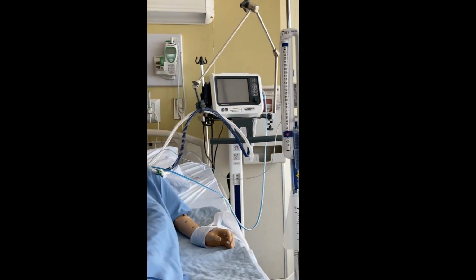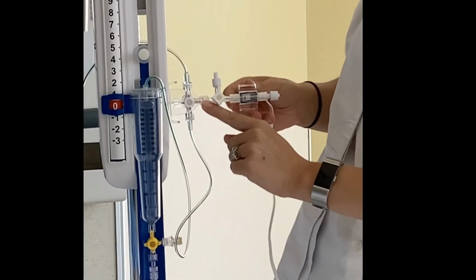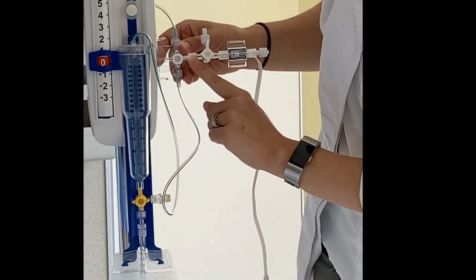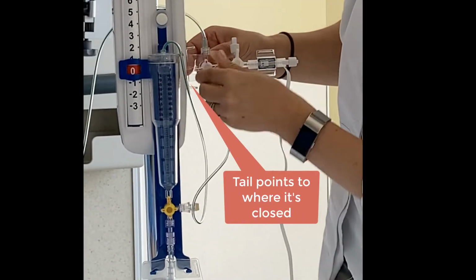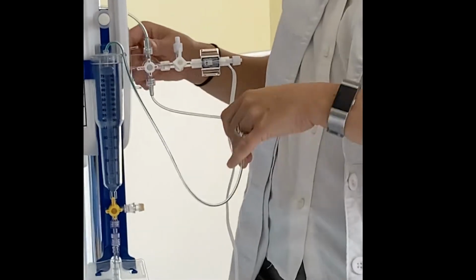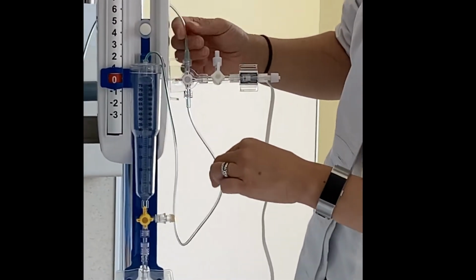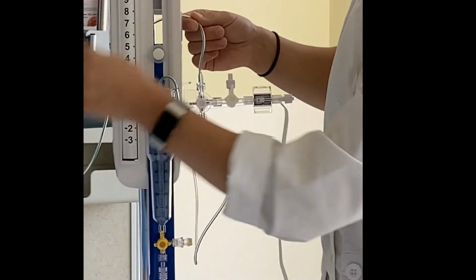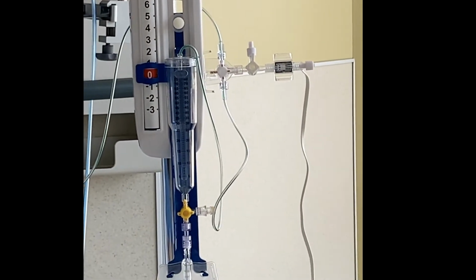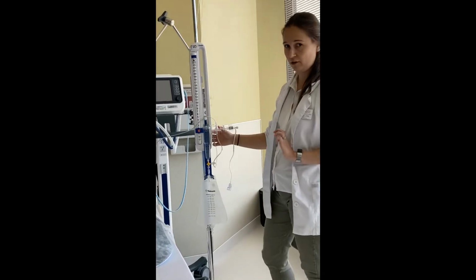Okay, if you look at this stopcock, right now it's closed to the transducer, so it's actually not sensing any pressure. So if I want to keep measuring my intracranial pressure, this needs to be open. So I'm going to open it to the system and to the transducer. Okay, so if I want to drain CSF, all of this needs to be open because remember, this leads directly into the ventricle and this is how the CSF will drain. Okay. So now I have my system set up to be draining CSF continuously.